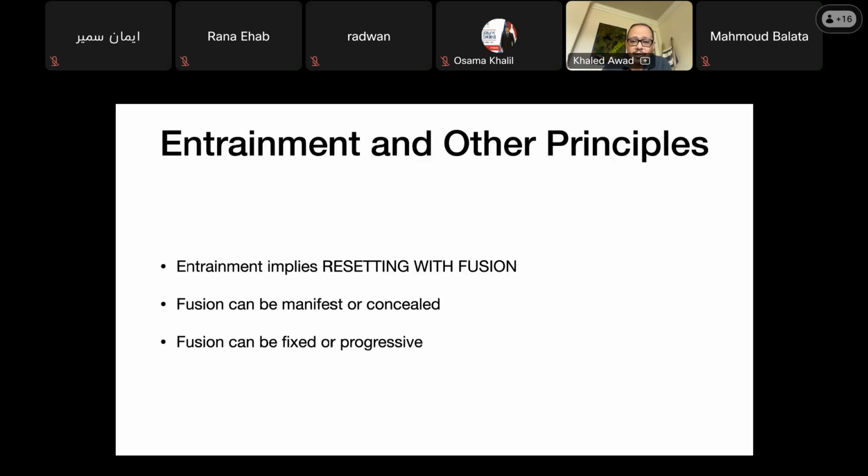Frank Marchlinski I trained with, and he would just do this pacing, and he would compare them, and he came up with his own charts. They're really amazing. Very, very detailed. But he looks at the general characteristics. Not every patient is going to have something, a little variation, but he looks at the general characteristics, and he knows exactly where he's pacing from, and that's the beauty of it. Pace at low output, and learn. And we need to approach EP from that perspective. We need to learn. We don't want to be told what to do. We want to define, and we want to write, and we want to innovate. That is very important.